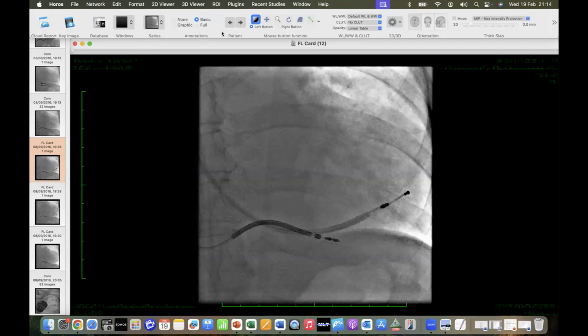The advantage of a dual coil in a patient is that if you want to shock across the thorax and your RV lead isn't sat in a nice RV apical bed, then you may not create enough of a shocking vector if you're going from the right ventricle to the right can to successfully defibrillate.